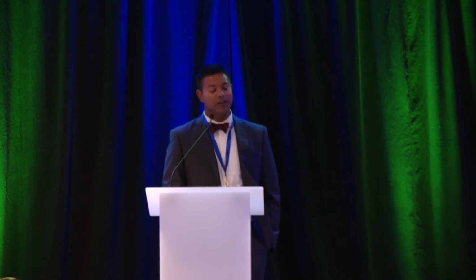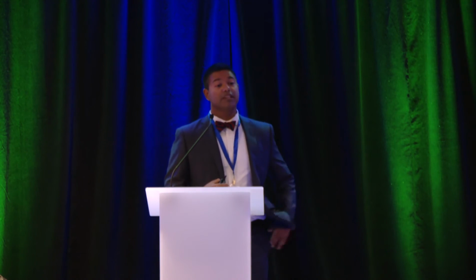A lot of our patients have anxiety around the procedure, and allaying some of that can be helpful. There's a lot of material on the internet, some better than others. There are nice videos on YouTube from Stanford and UCLA that we found helpful. So patients are typically made NPO for at least 4 to 6 hours prior to minimize the risk of aspiration. Apply the nasal anesthesia. And catheter insertion is typically performed with the patient sitting upright, facing the operator, drinking small sips of water through a straw to facilitate placement of the catheter.